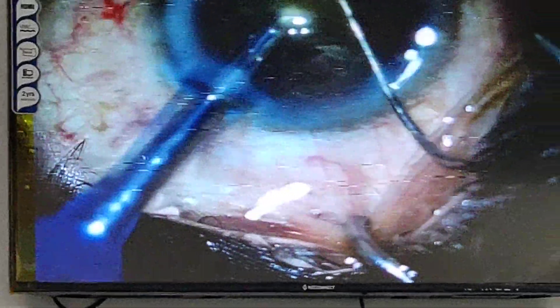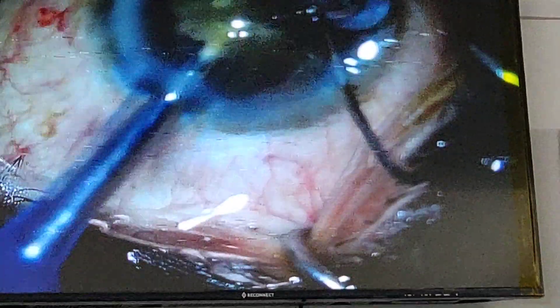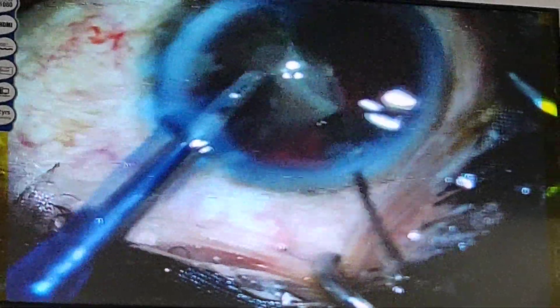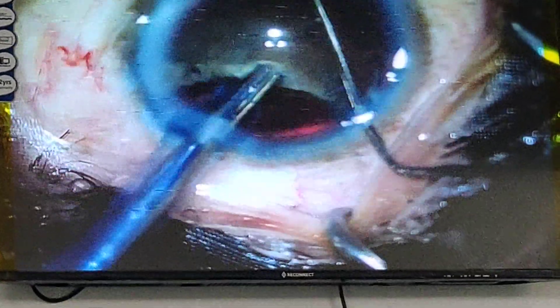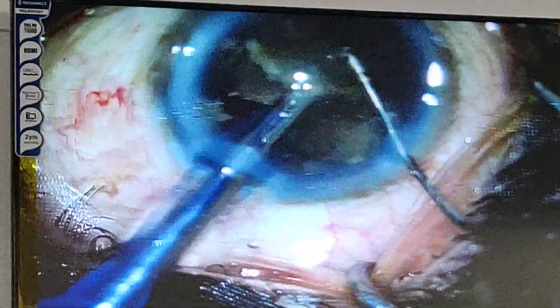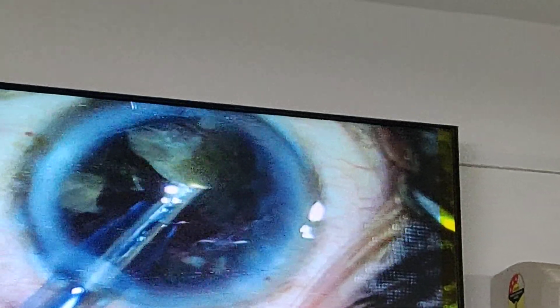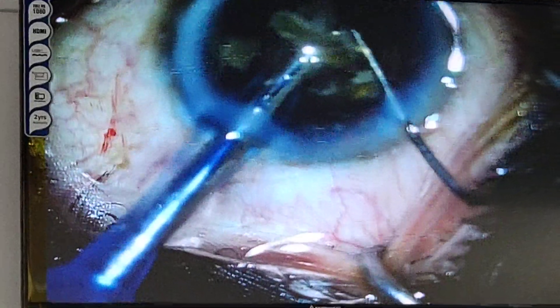This is the second piece — you can see it — and now after emulsifying the second piece I am going to rotate the half part of the nucleus. The half part is emulsified, so I rotate it, fold it like this, bring it to the center, and then chop it. I am going to inject viscoelastic with my other hand to protect the endothelium, rotating very slowly. Here you can see the last nuclear fragment being emulsified.